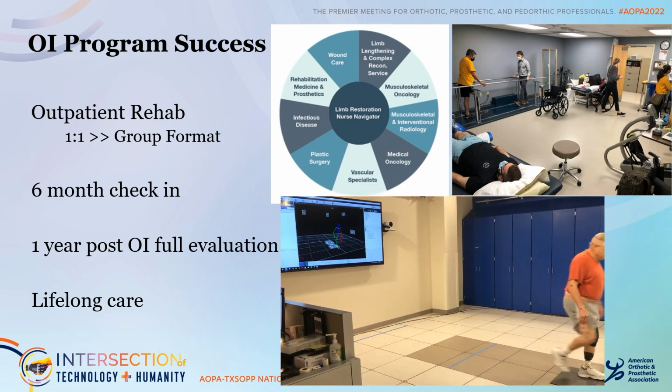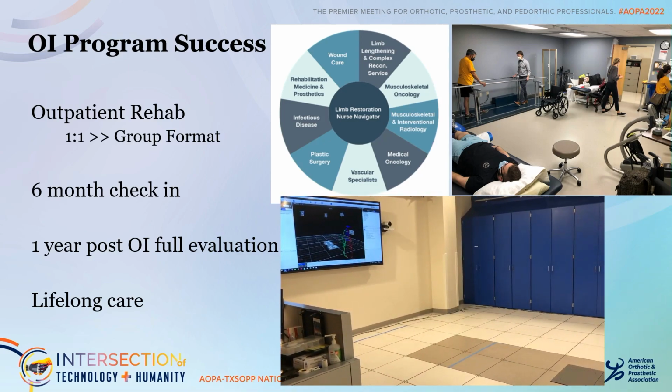Again, this is a lifelong endeavor, so our patients are with us for life. And so we follow them very, very closely, and we have to be a resource for these patients because things will happen, and it is not a static type of procedure. Soft tissue, people gain weight, lose weight. There's all sorts of things that can happen.